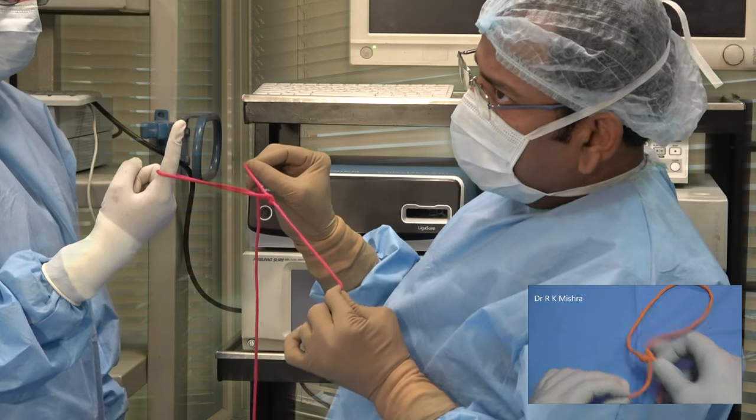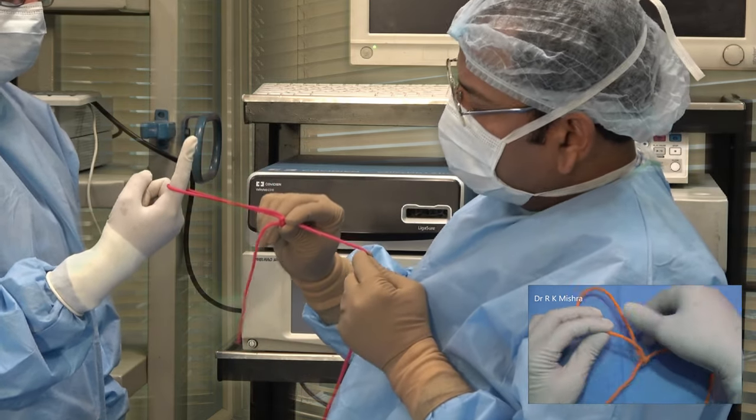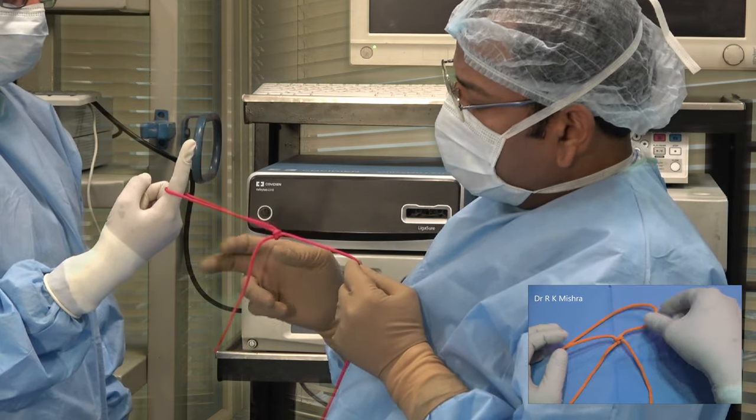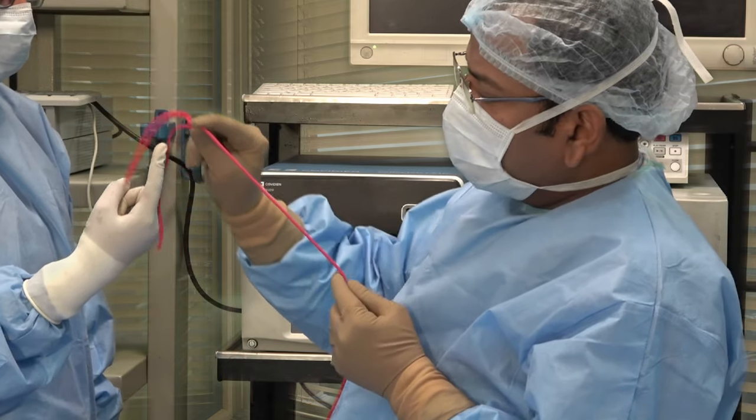To lock it, just pull the tail and it gets locked. You can use it for Burch suspension, sacrocolpopexy, myomectomy, or vault closure. This is a beautiful locked knot that is called the Weston knot.